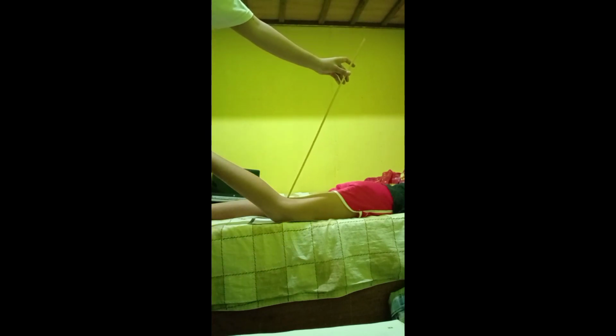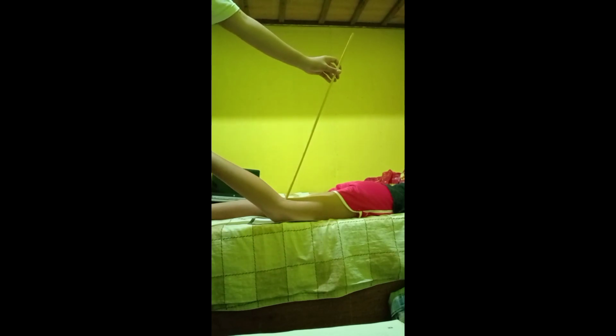And then, flex the patient's knee approximately 40 to 50 degrees. So, naka-flex na rin siya 40 to 50 degrees. The central ray is perpendicularly directed to the patient's lower leg. This projection will demonstrate to us the intercondylar fossa free from superimposition and the intercondylar eminences.